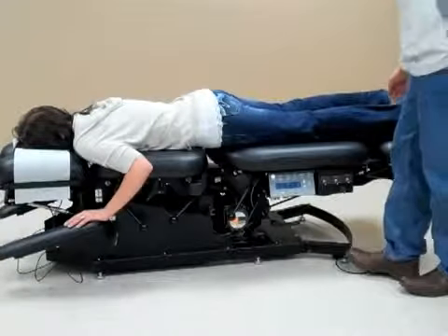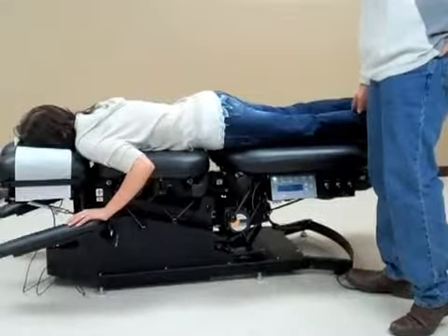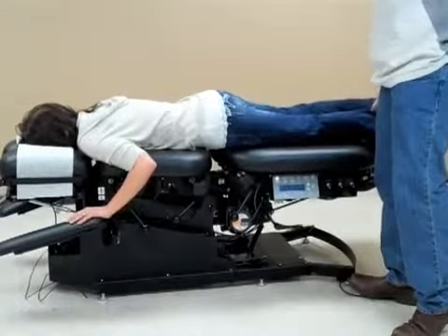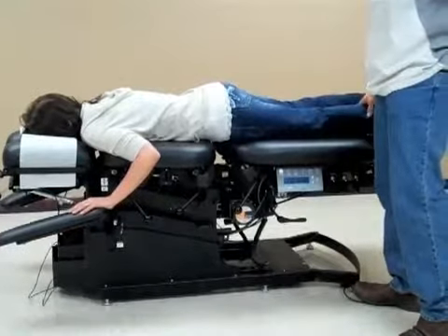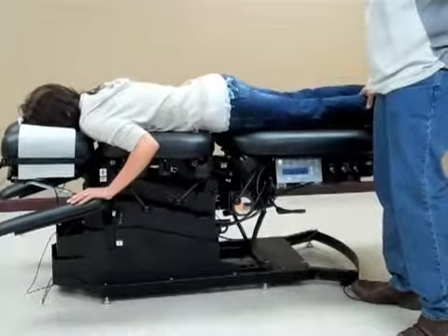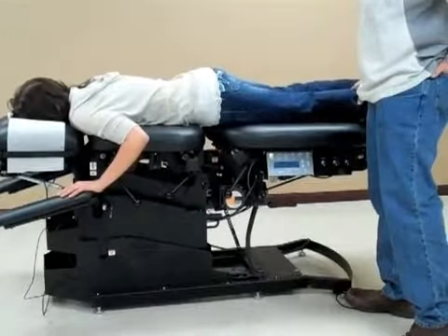Once we have the patient on the table, we're going to elevate the table to a higher level to make it easier to put the ankle straps on and to maneuver the patient on the table. I'm going to elevate the table up to the highest level where it's easier for me to work on.